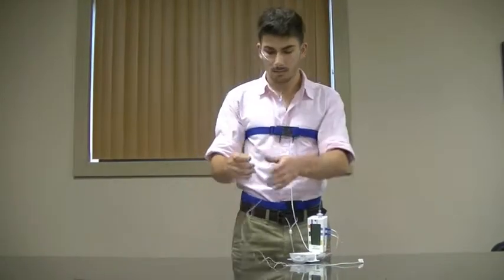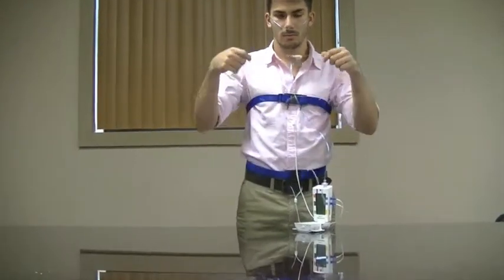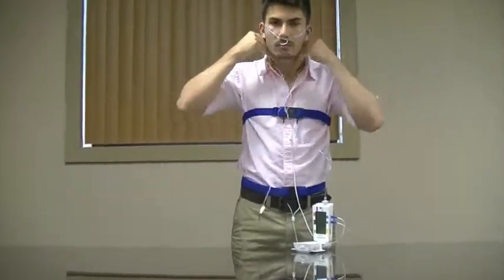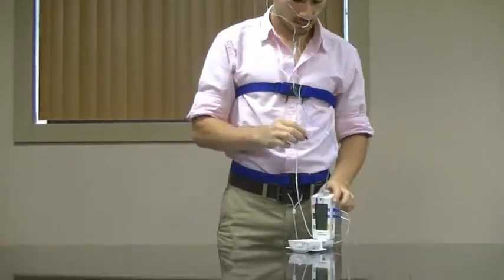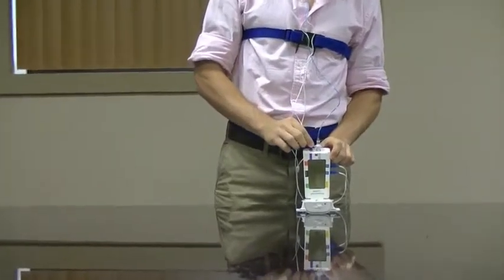Now we will attach the snore mic. This will be positioned the same as the nasal cannula, going up and around your ears. You will want to make sure that the mic is positioned by your mouth, then attach it to the top of the device.